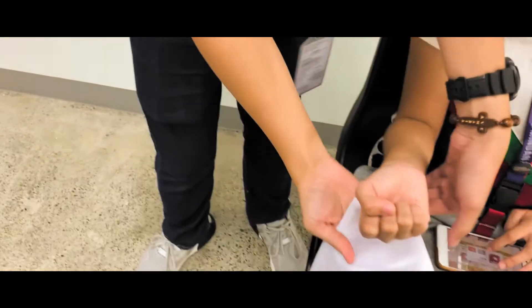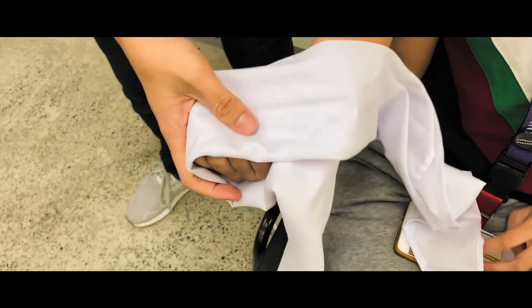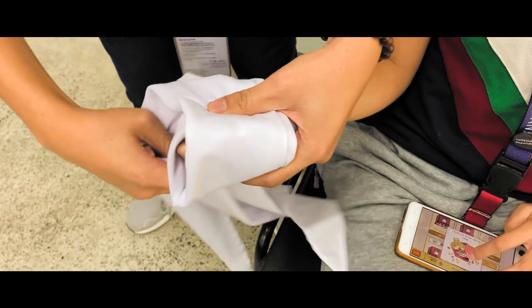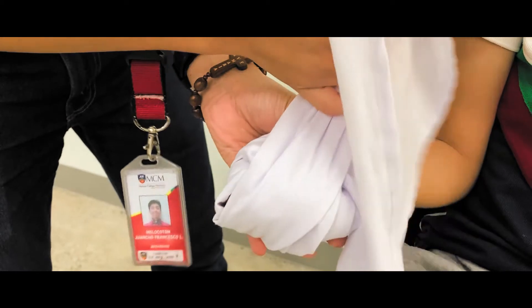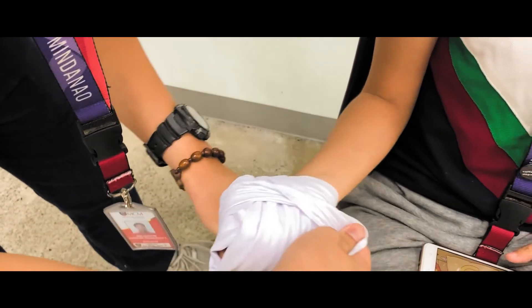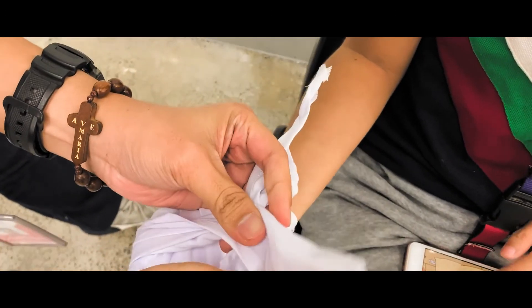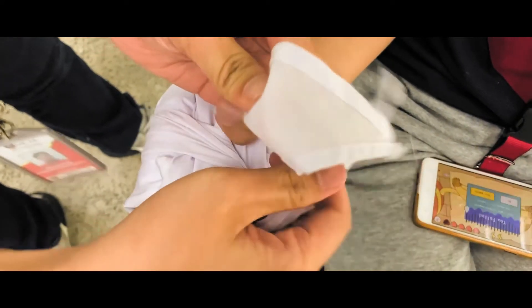Still using the narrow cravat, place the bandage on the back of the patient's hand for a closed fist bandaging. Cross it over the hand until it is wrapped well enough.